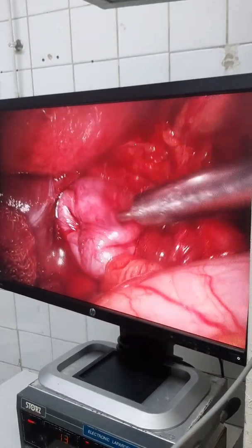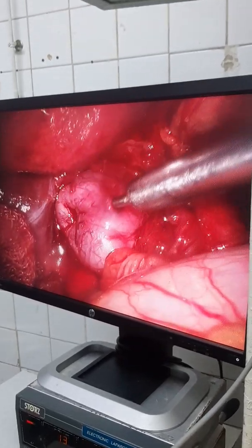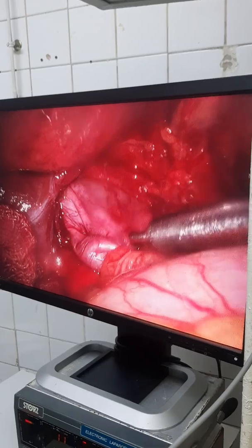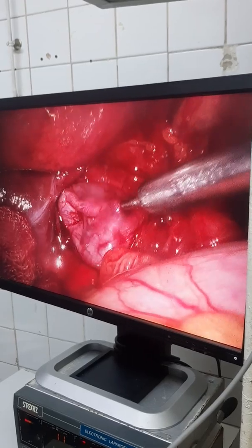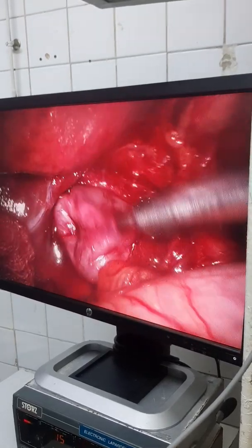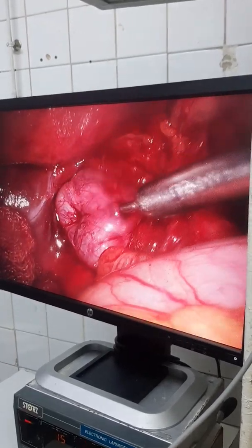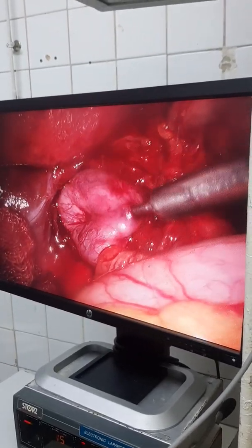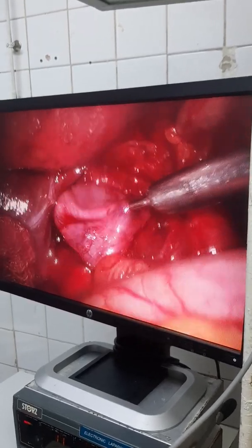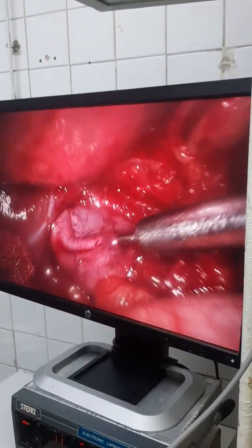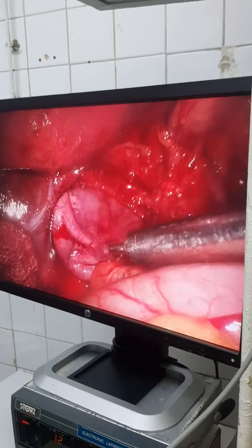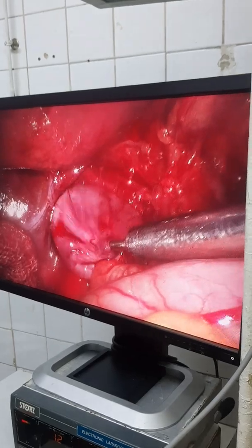You can see the pulsation through the cyst. The cyst is above the IVC. You can see the pulsation of the IVC behind the cyst.